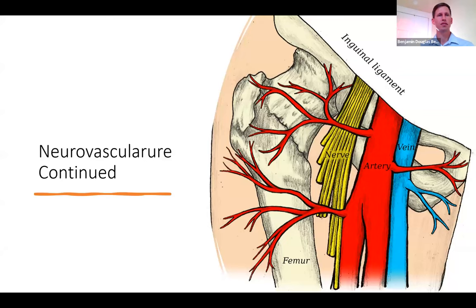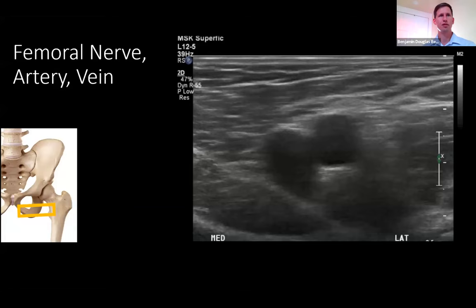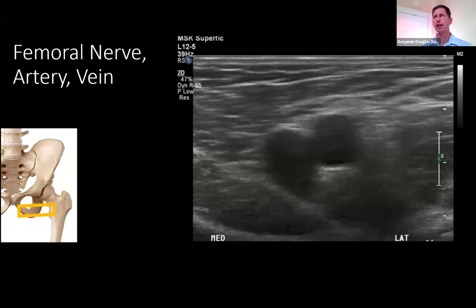Next, evaluate the neurovascular structures — the femoral nerve, artery, and vein. Apply color Doppler over these structures to confirm normal flow, with the vein being more medial than the artery and the femoral nerve laterally.